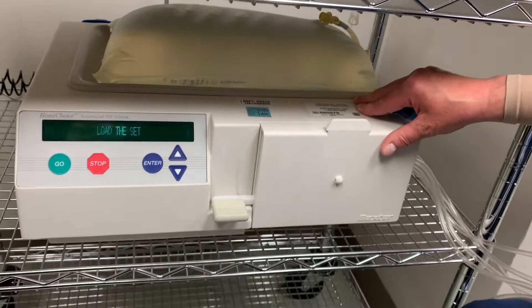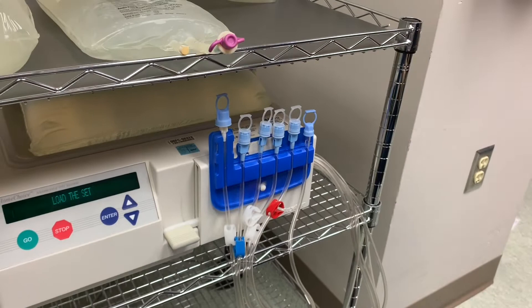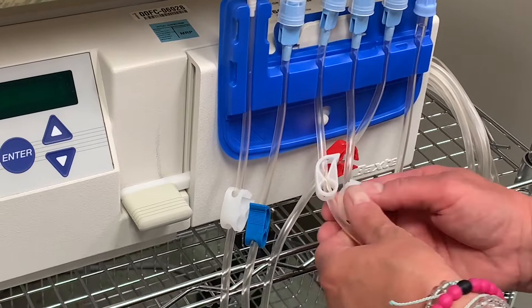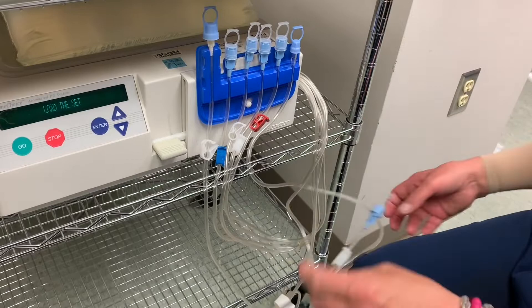The patient organizer has a slot and a little button — just snap it over. Then clamp all the solution lines starting with the blue one. Do not clamp the patient line. There are four lines on the high side — one, two, three, four — and also one down here on the drain line. This is just a sample port; make sure you clamp that, otherwise you'll have a mess.